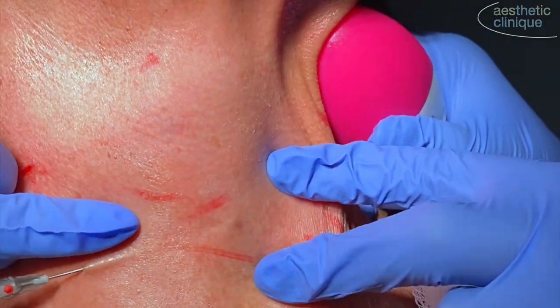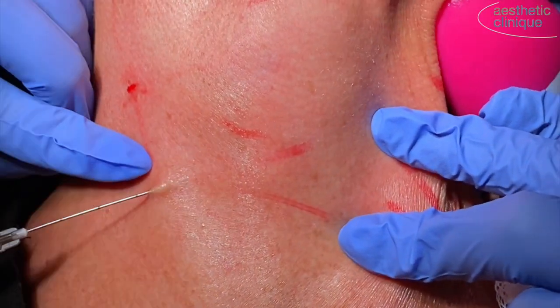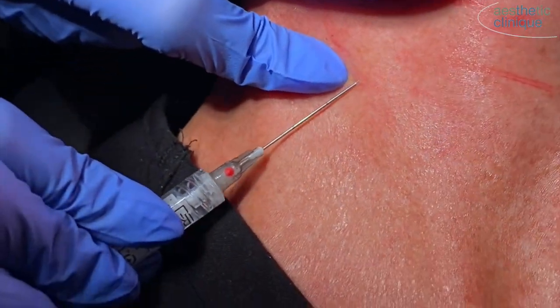Hi, this is Dr. Weiner, and I'm showing you my PA, Brittany Brock, doing hyperdilute injections of the neck.